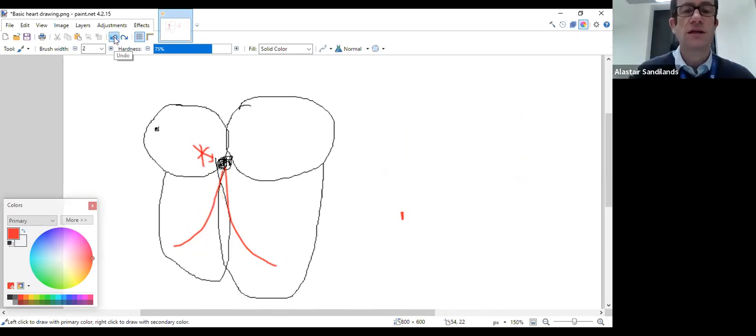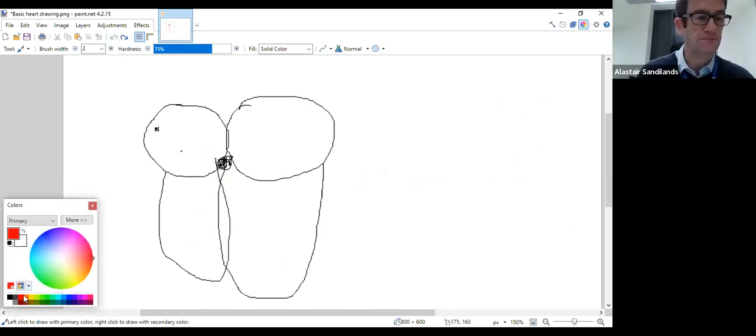So let's talk about bifascicular block then, as we're talking about right bundle now. What does this mean? Again, we've got the right bundle. Draw this colour. So we've got the left. This is called the left posterior fascicle. The left bundle is actually split into two. And then you have to think of this in 3 dimensions. It's coming forward.